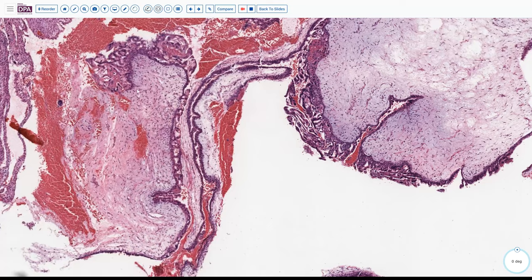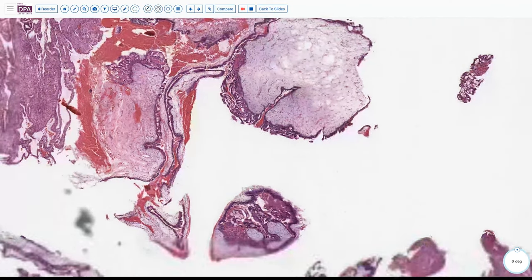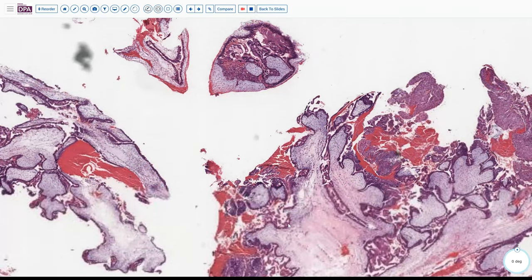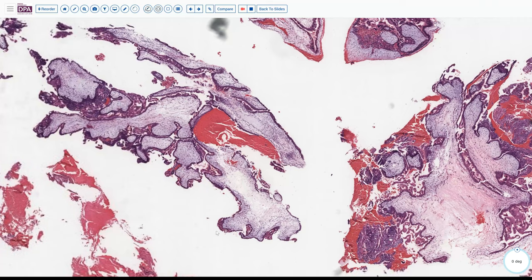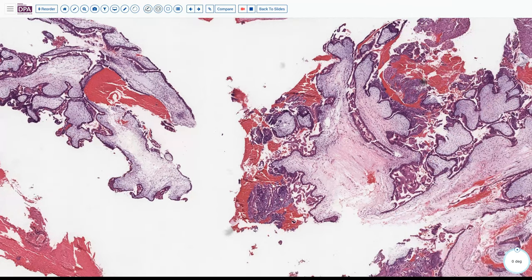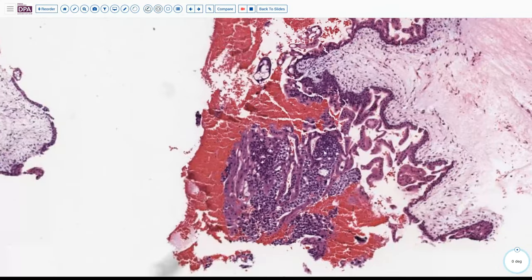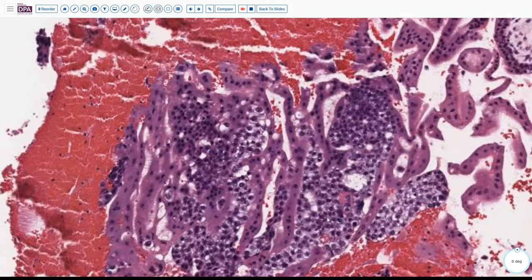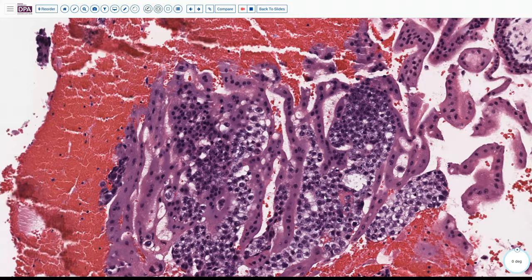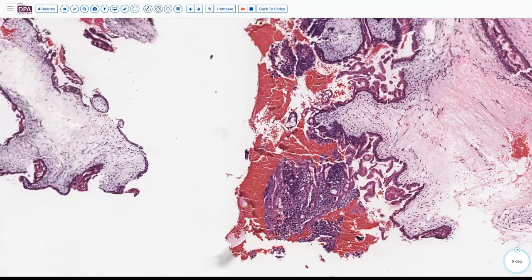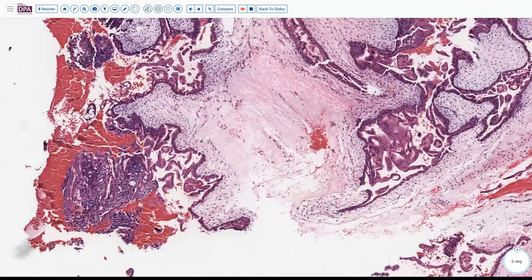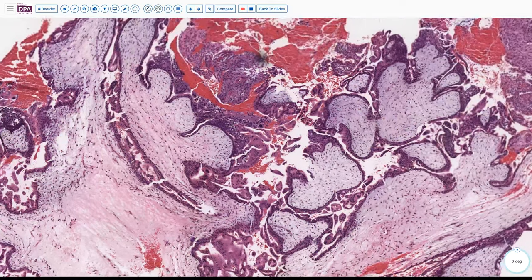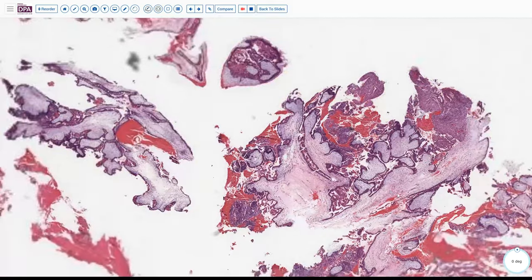Here's some rather exuberant trophoblast. Looking at some of these other areas, we see some cisterns, maybe some scalloping of these villi, and quite a bit of trophoblastic proliferation. Looking at a little higher magnification, there are not a whole lot of atypia here — fairly normal appearing trophoblast — but that can be deceptive. And here we see this cistern formation, edematous tissue, and these scalloped and irregularly shaped villi in the tissue.